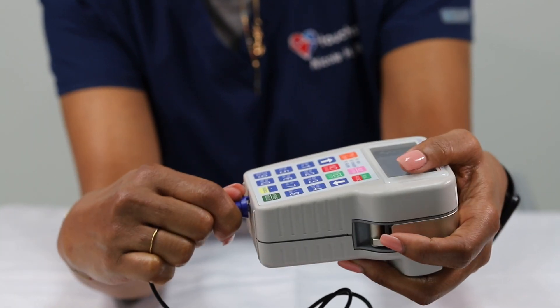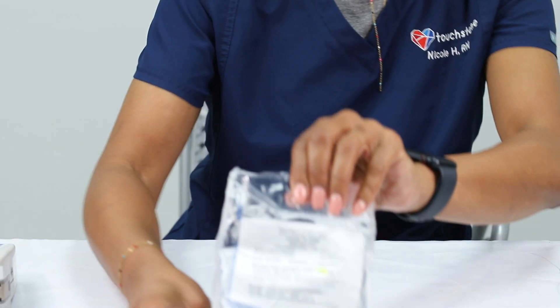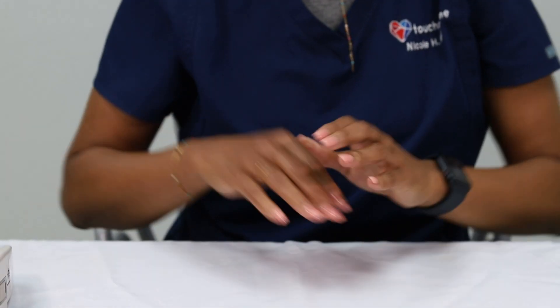Before stopping and disconnecting your milrinone or dobutamine infusion, you must first prepare your new infusion using the Curlin pump. Typically, your IV bag has been spiked, which means the IV tubing is connected to the bag and simply needs to be loaded into the Curlin pump and primed.